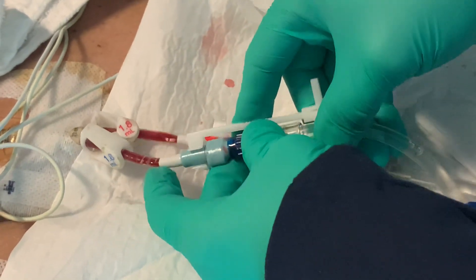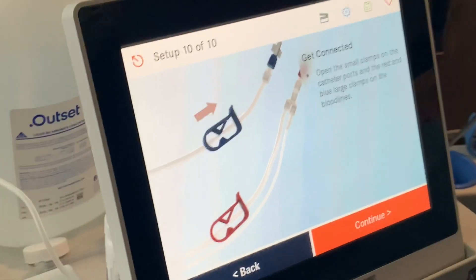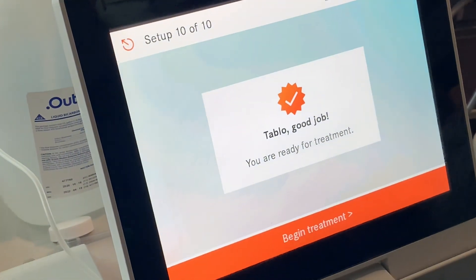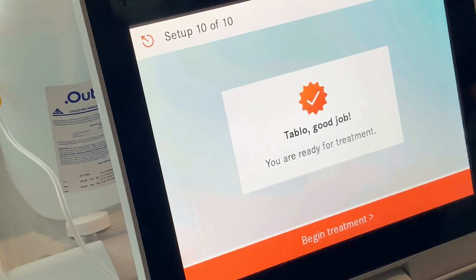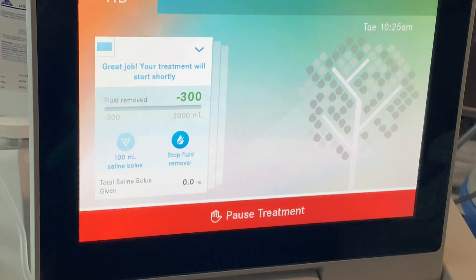It's a nice thing to have, but it's not unnecessary. All right, once all the lines are open we're just going to click continue. Great job. We can begin the treatment. There we go.